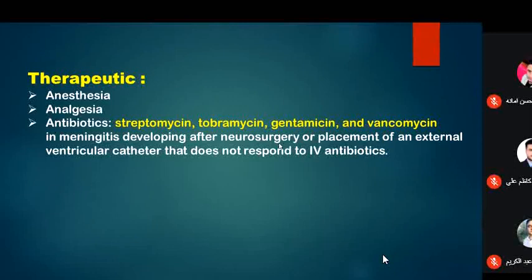What do we mean by external ventricular catheter? In which cases is it used?